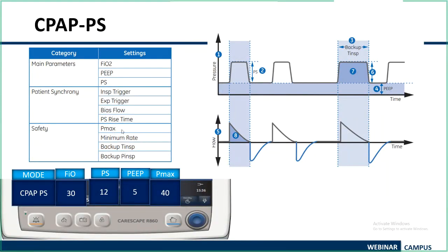What is another parameter which you can set here? Anyone? We can set an apnea time also. Suppose you keep an apnea time of 30 seconds, even if the patient is not generating any breath for 30 seconds, the machine will wait. Even after 30 seconds, if there is no breath, the machine will move on to the control breath, where you have already set the IE ratio and the backup pressure. So if you keep a T inspiration, obviously the rate and IE ratio will be fixed from that, and the pressure control mode also will move from here.